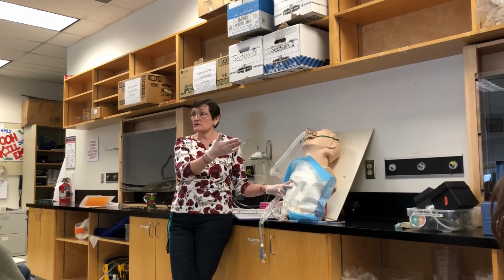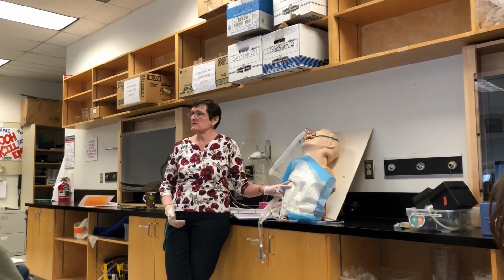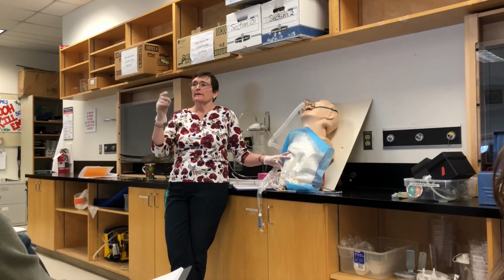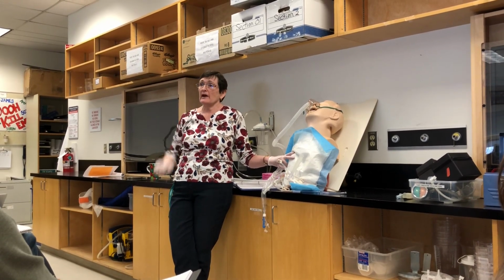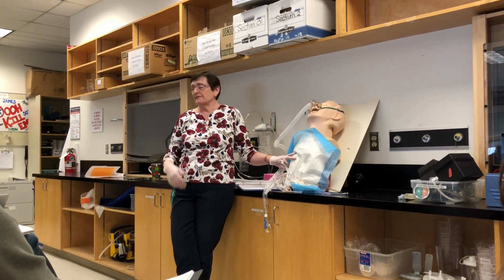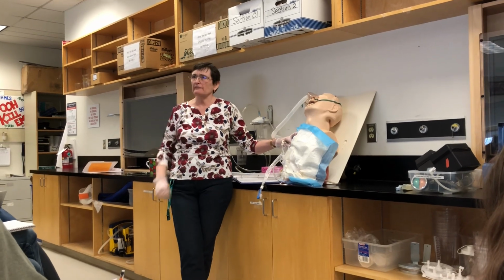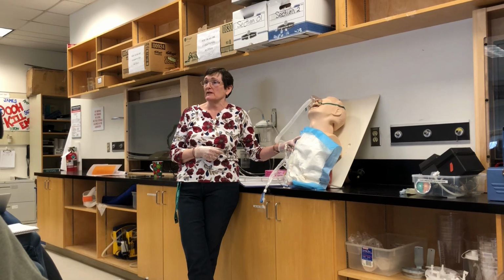Really, the nurse is there as well, because you're most likely doing this in an intensive care unit. The nurse that's looking after this patient will be with you the whole time. So that if something should happen, like a huge amount of stridor, then we're going to call everybody in. The intubation cart's outside the room, in case we have to re-intubate the patient. If they're asthmatic, we're looking for bronchospasm, we may have to give them some salbutamol. But primarily we're looking for whether the swelling is becoming so significant that we may need to re-intubate.